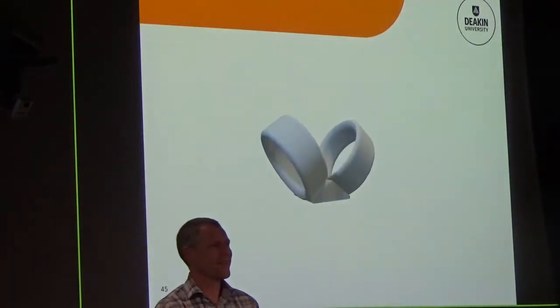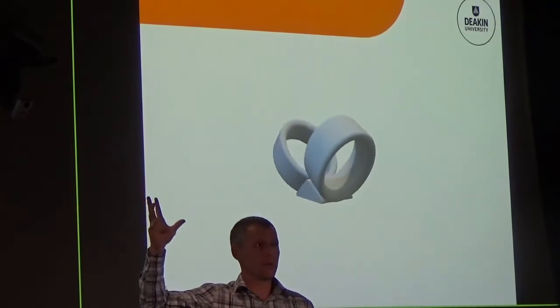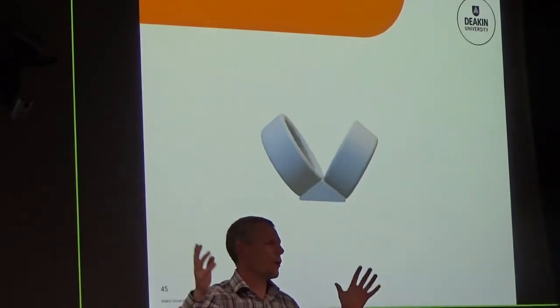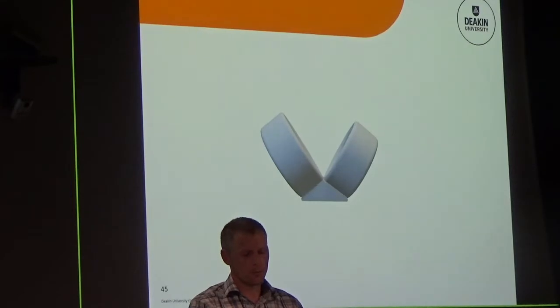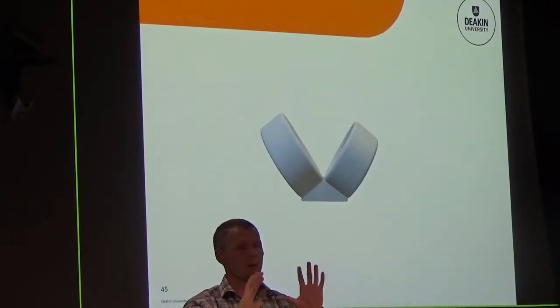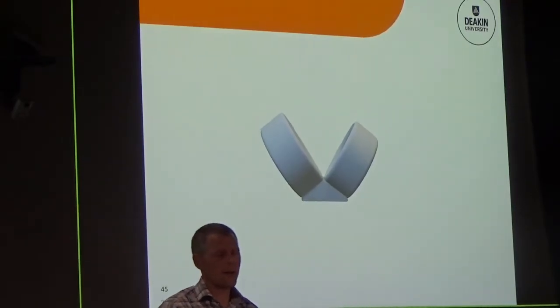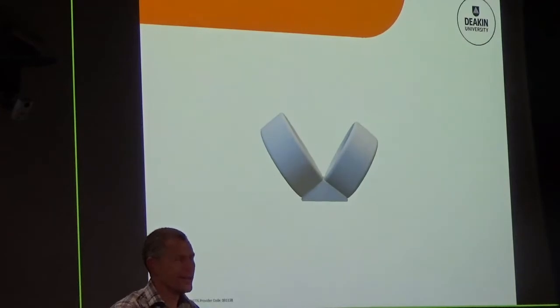How much storage do you need in the computer? Yeah, so storage is good. Basically, a 3D image is lots and lots of photos. Previously, before some nice people designed good apps, what people would do is go around an object and take lots of photos of it, and then put all those photos together to create the surface of the image, your water bottle or whatever. So there's lots and lots of photos taken to get the surface view of whatever it is. So in terms of that technology need, there is storage required.